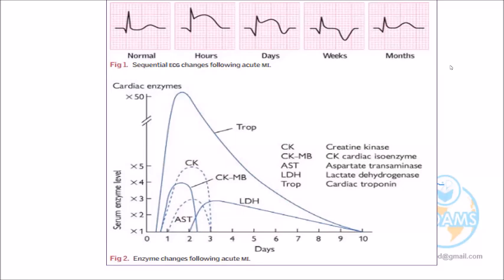We can say, yes, myocardial infarction happened. If associated with the ST elevation, then we can say it is acute myocardial infarction. For that, nowadays terminology is ST elevation MI and non-ST elevation MI. Both are MI. So why MI actually? Because there is muscle damage and troponin I is high.